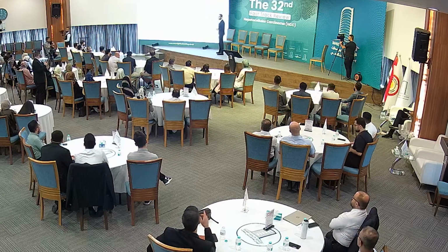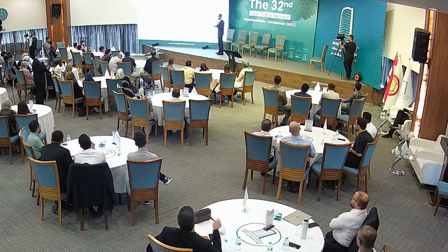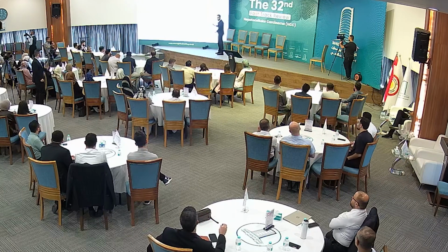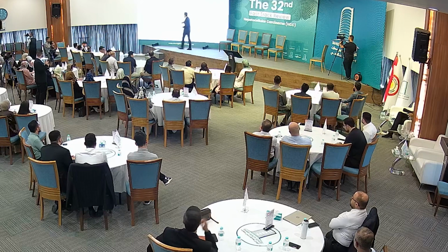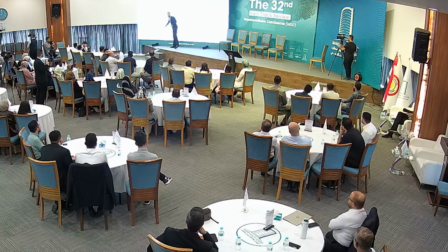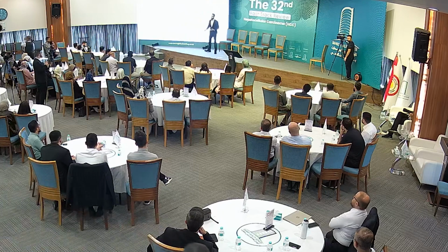I currently have a case on hold in which they took a biopsy from a liver tumor, and it's very well differentiated. So I have to take some extra steps to say whether this is cancer or this is a dysplastic nodule. Okay, so we need to distinguish early HCC or very well differentiated HCC from dysplastic nodules. These are pre-malignant lesions. They're not cancer, their management is different. So what are the features that we can use for this?